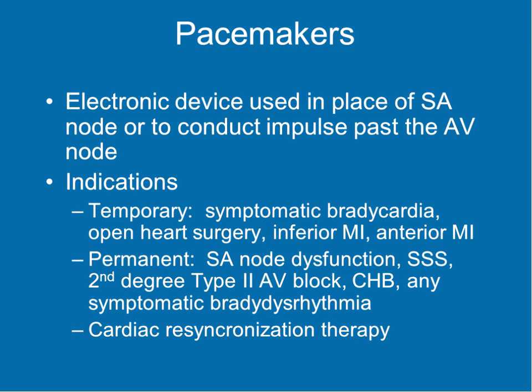All right, a little bit about pacemakers, and I think that'll be all that we have to do. Okay, pacemakers. These are electronic devices, and they are used in place of the SA node, or they're used to conduct the impulse across the AV node if there's a block in the AV node that isn't allowing that to happen naturally.